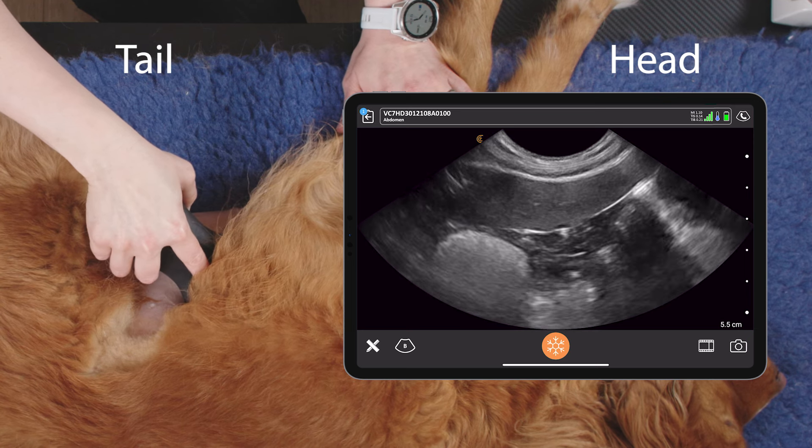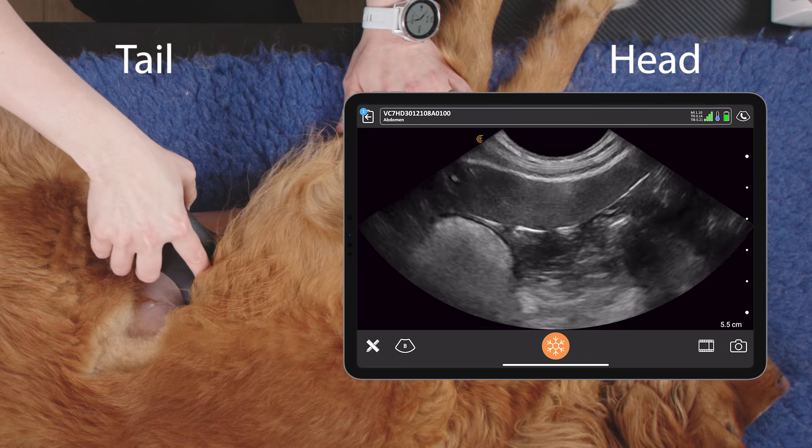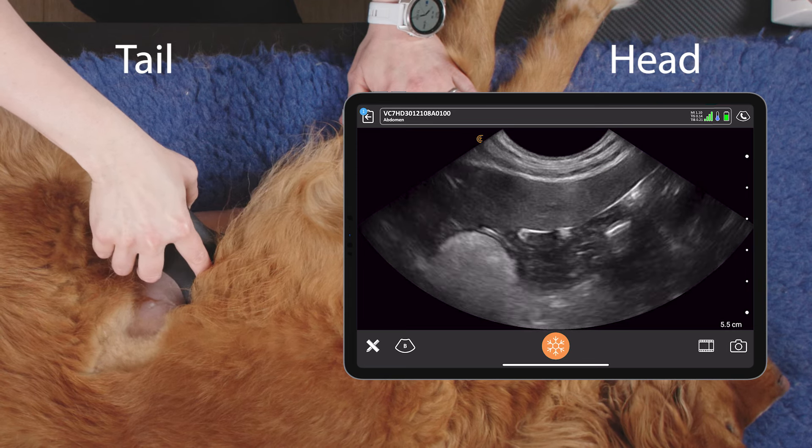It's easier to do in cats as the left limb of the pancreas is longer, but still sometimes we can spot it in dogs. That's how to scan the left limb of the pancreas.